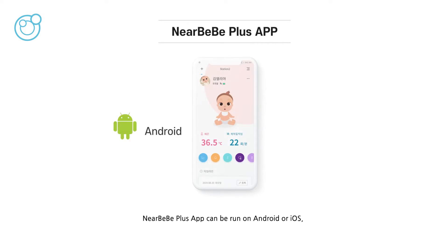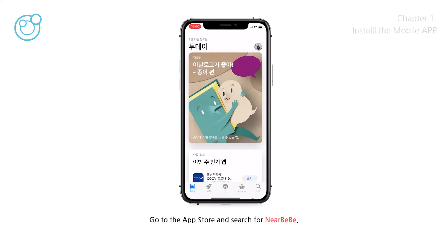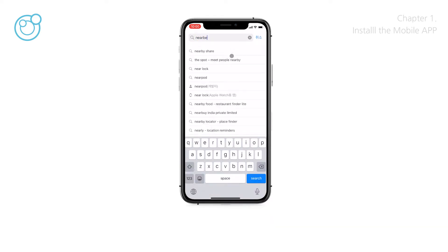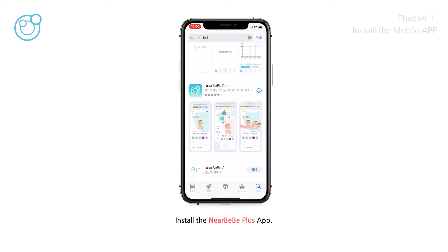The NearBeBe Plus app can be run on Android or iOS. In this video, the demonstration will be made based on iOS. Go to the App Store and search for NearBeBe, then install the NearBeBe Plus app.